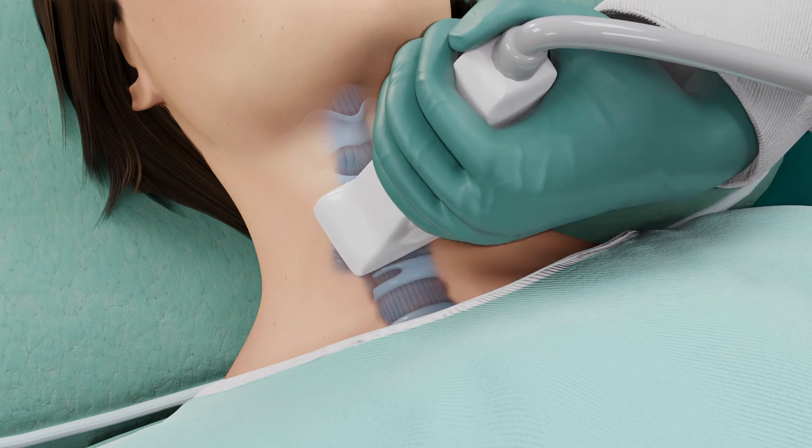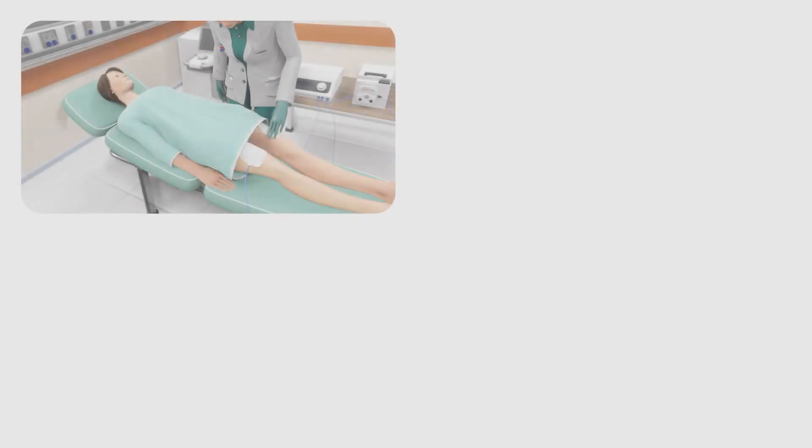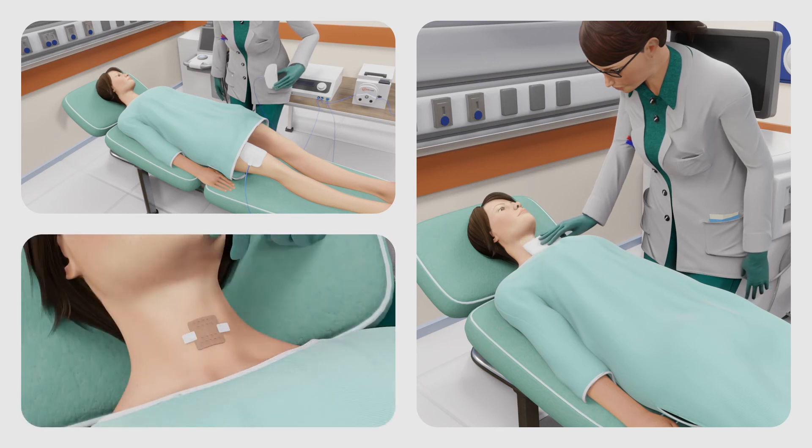Once the nodule is treated completely, the doctor will perform a final ultrasound scan to ensure the best possible results. Once satisfied, the electrode and grounding pads will be removed, the insertion site will be cleaned, and a small bandage will be applied.